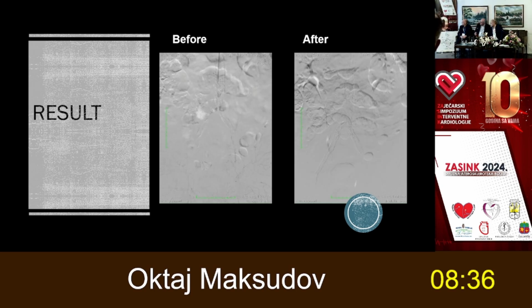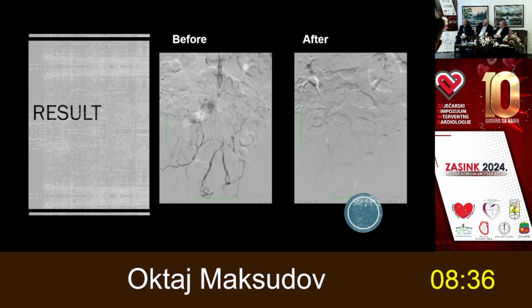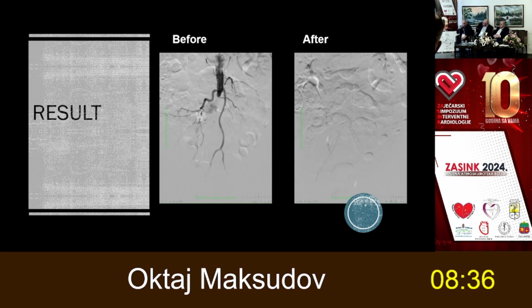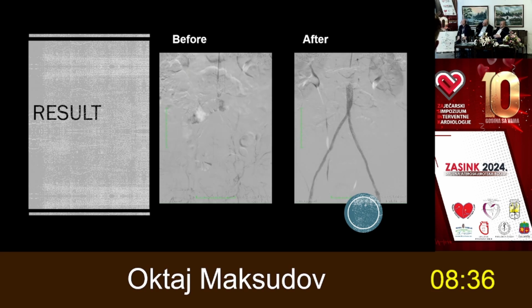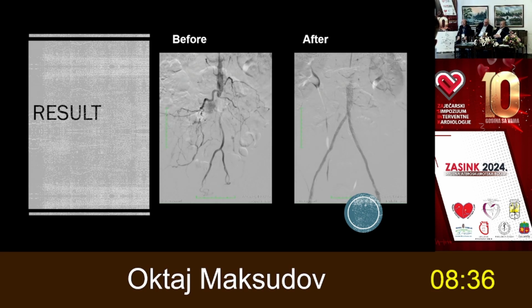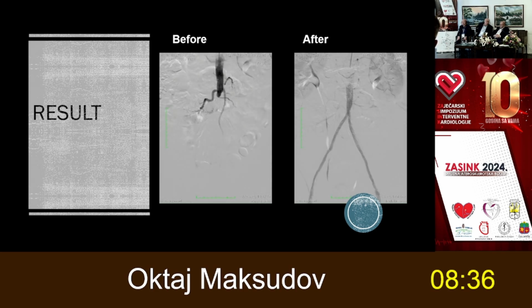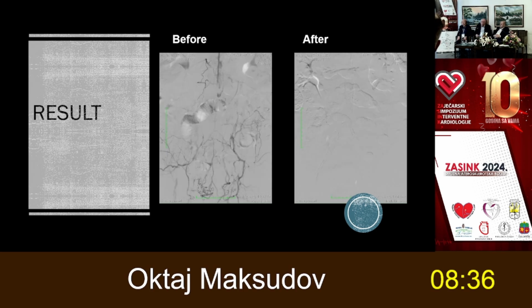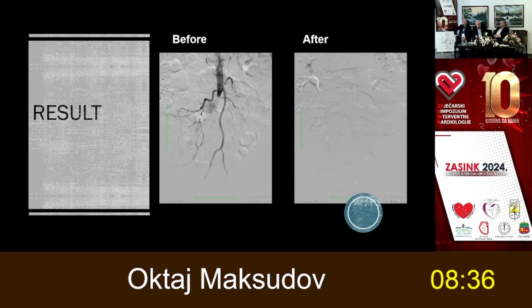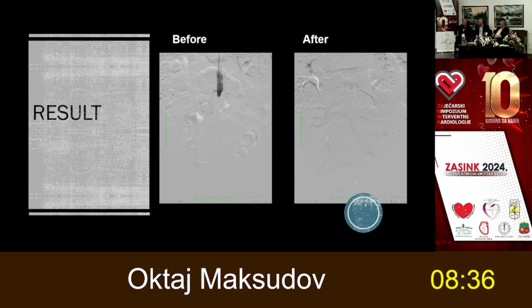If IVUS is available in the cath lab, can you do an IVUS run for this segment? Maybe you will understand what is the length of the dissection. I think that we already understand it by intuition. Maybe just close the mouth of the dissection and it will close itself down. Yeah, it's easier because he doesn't have to pull the second introducer sheath.